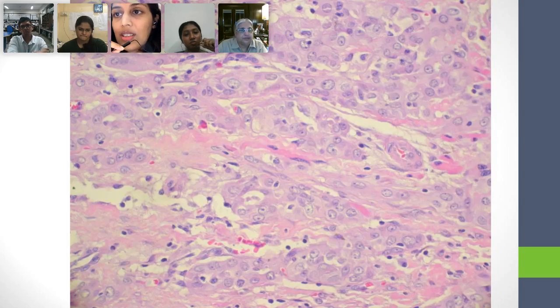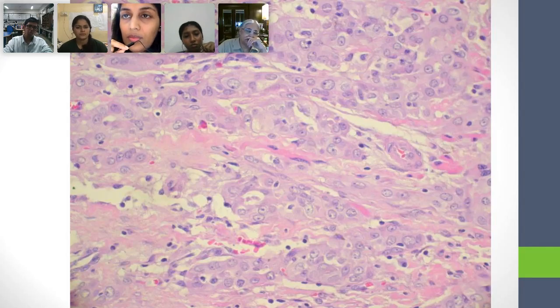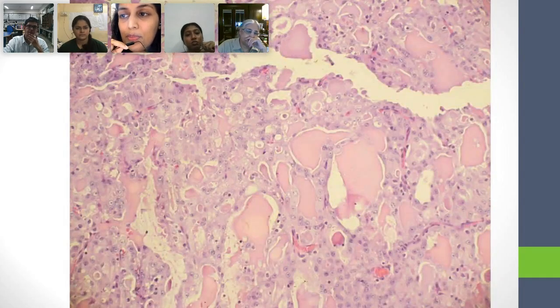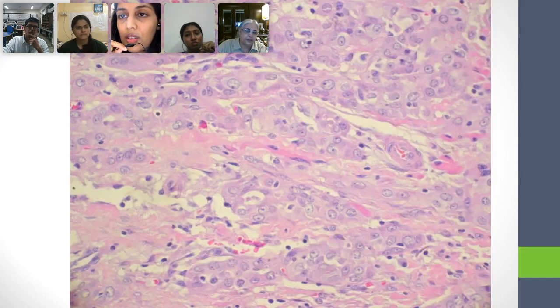Here, what do you see? Here, ma'am, I feel the cells are taking a sort of sheet-like appearance, or some look like cords also. All right. And again, the cytoplasm is eosinophilic, moderate to abundant in quantity. There are these small lumina present. Some of them must be the vacuoles in the cytoplasm. Actually, the cytoplasm both here and in the previous one is not very pink, it's more amphophilic, right? Pale, varying from pink to eosinophilic to amphophilic.